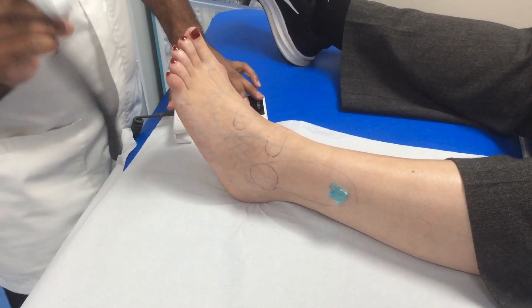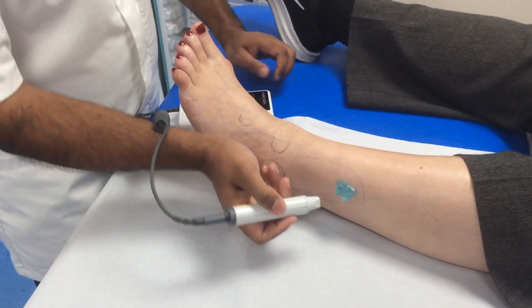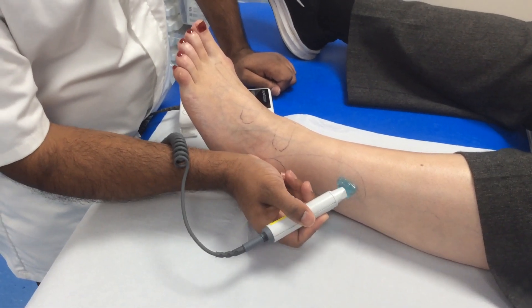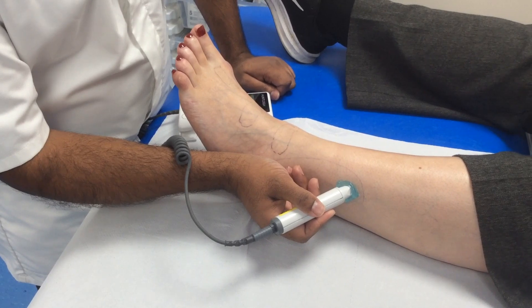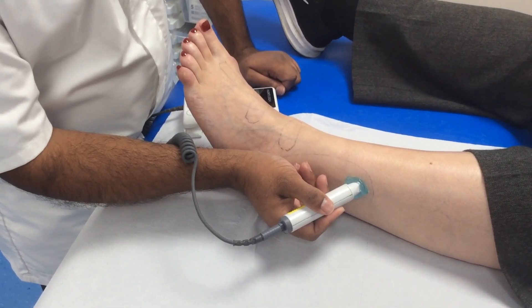Using an 8 megahertz Doppler probe, anchor your hand against the patient's ankle, sit the Doppler probe gently in the ultrasound gel, being careful not to apply too much pressure on the skin.